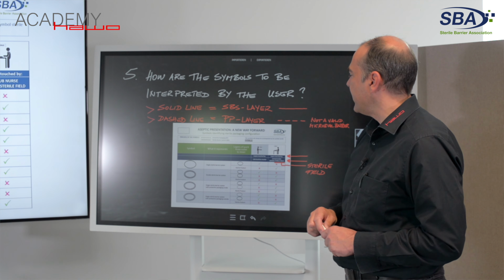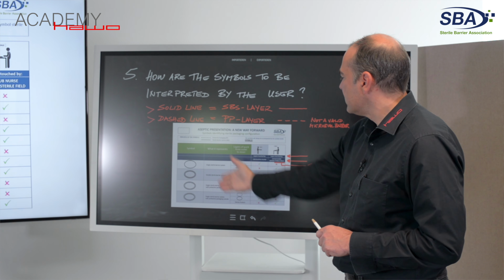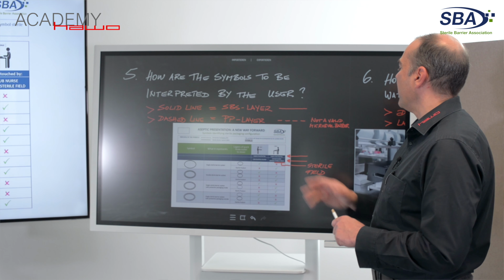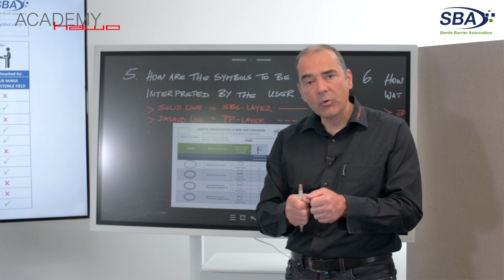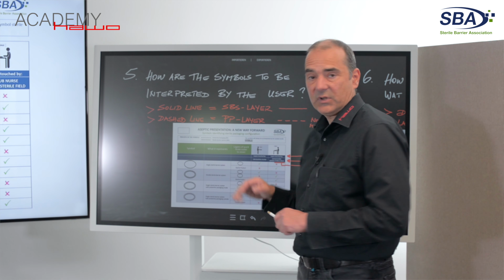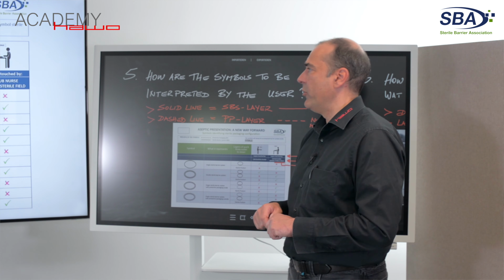Within the SBA guidance document, you have a very nice, very detailed table describing the individual symbols, as well as whether or not the employee or nurse opening the packaging is staying in the sterile field, so keyword scrub nurse, or layers touched by the circulating nurse.